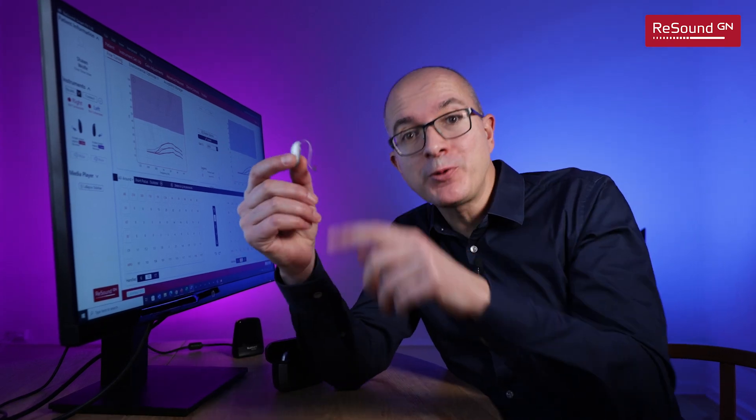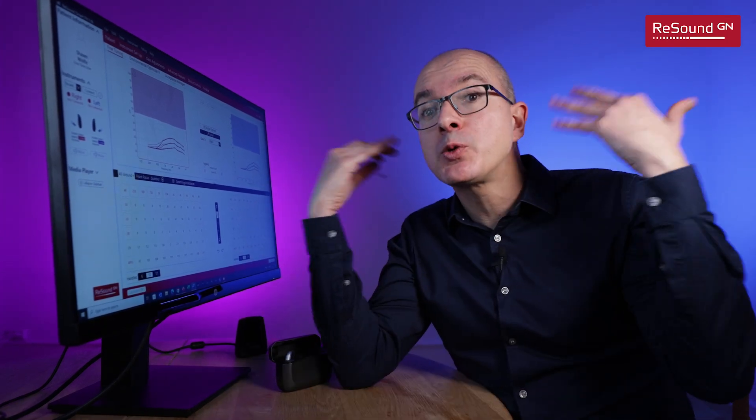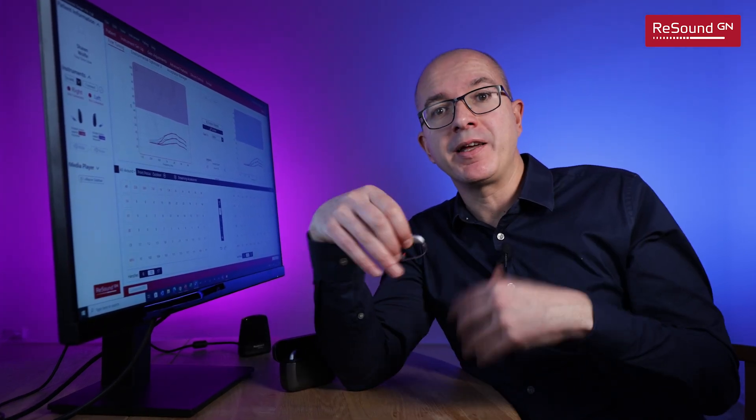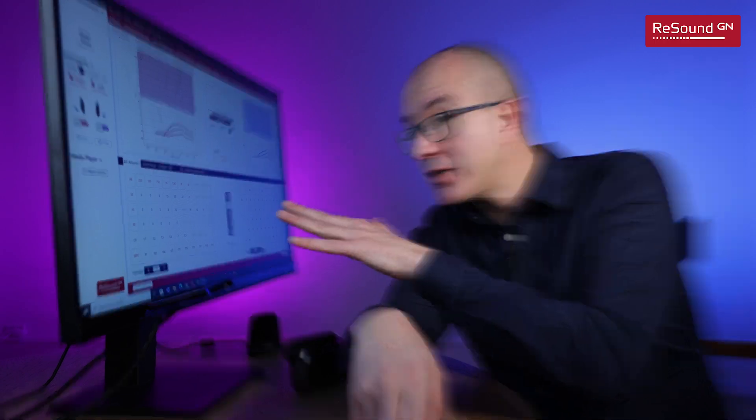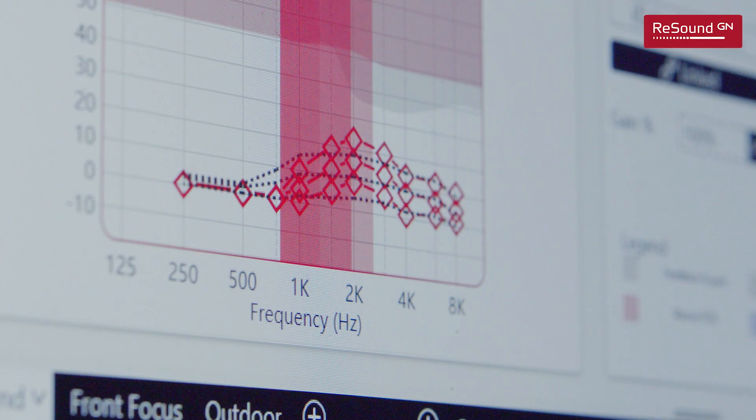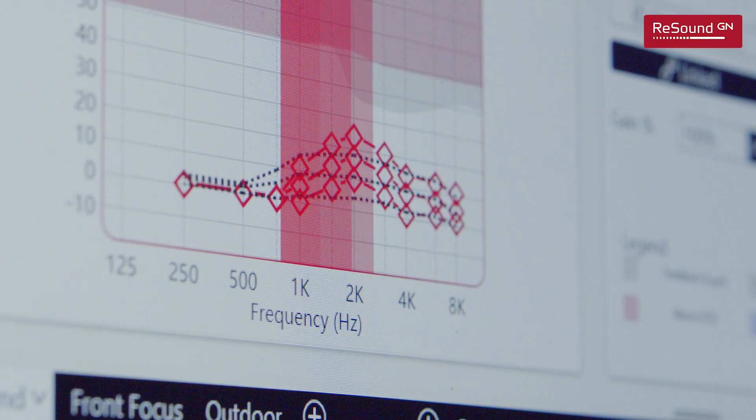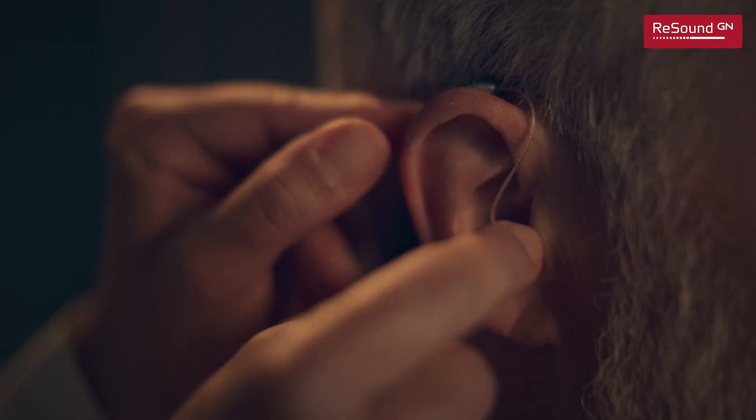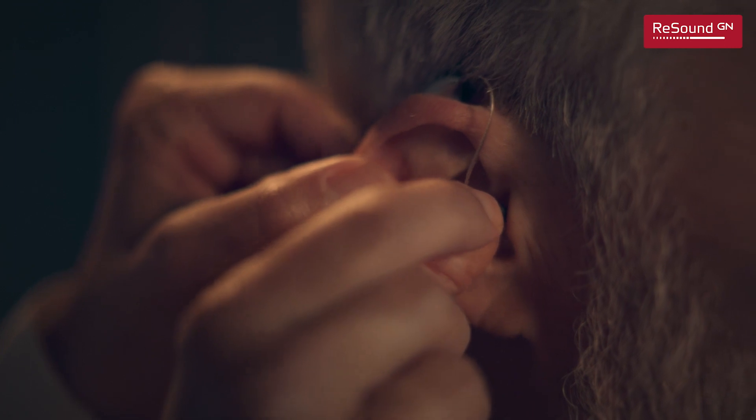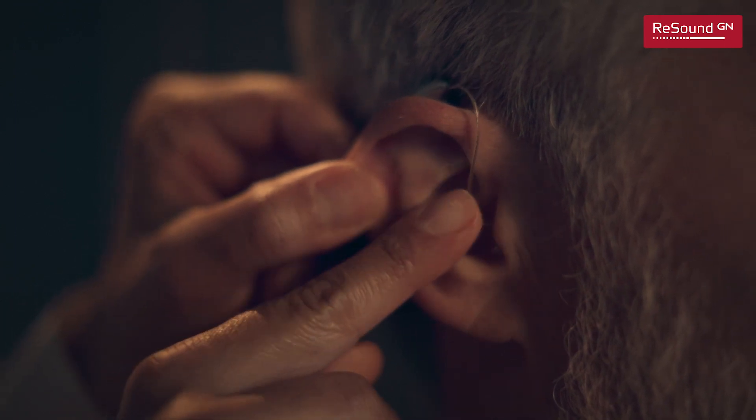The main reason why people use hearing aids is to hear better in background noise, and the fitting software is the most important tool you have to make sure that the hearing aids are properly fitted to each one of your clients.